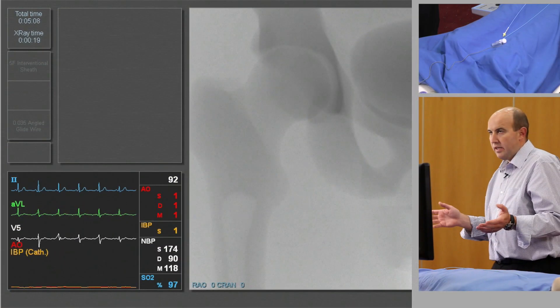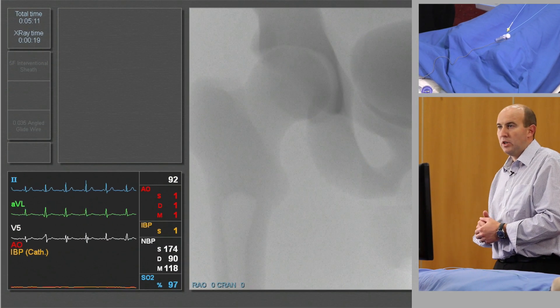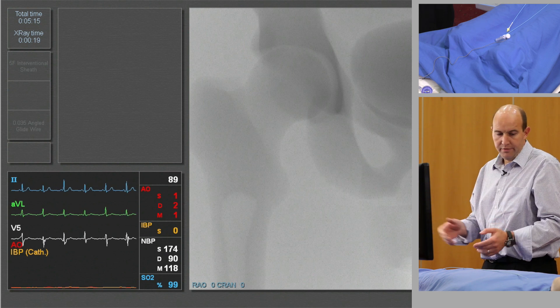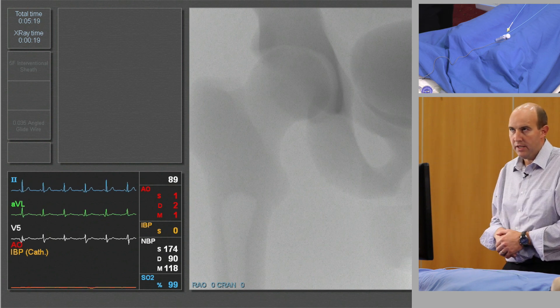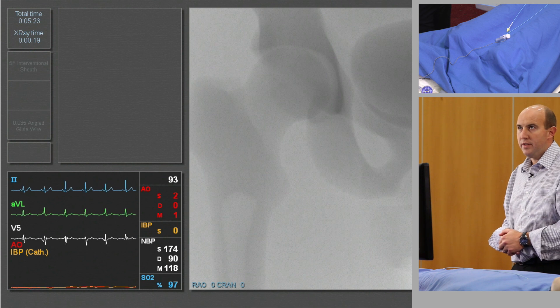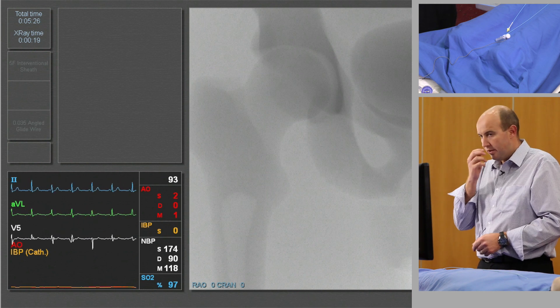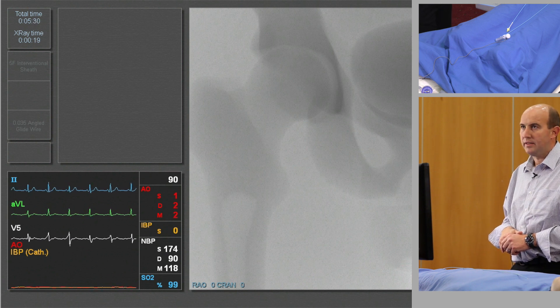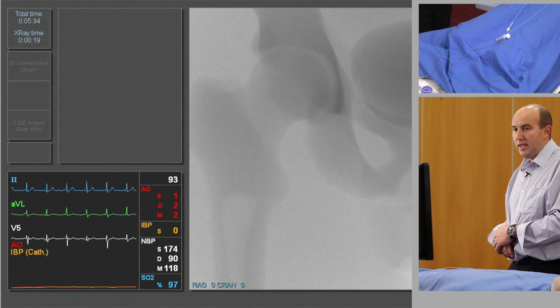The case is a 75-year-old gentleman who is a calf claudicant. We have the setup as shown with his vitals on the main screen. We've already pre-selected a five French interventional sheath to go antegrade into his right groin, and pre-selected the wire — we'll come back to that in a bit more detail later.